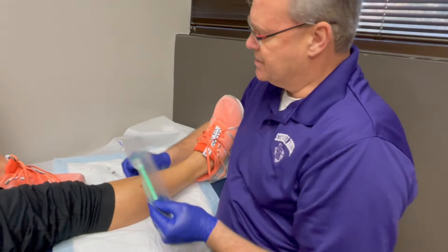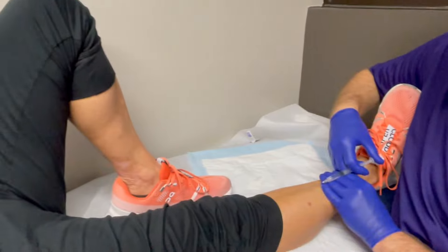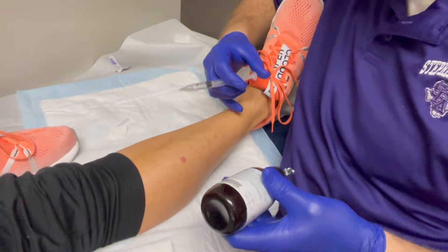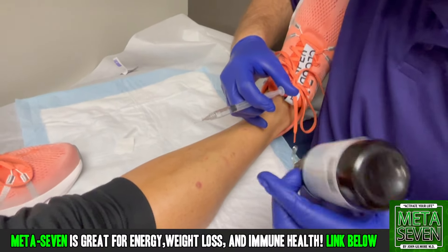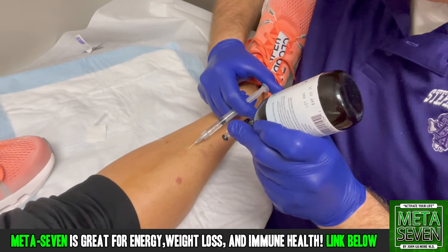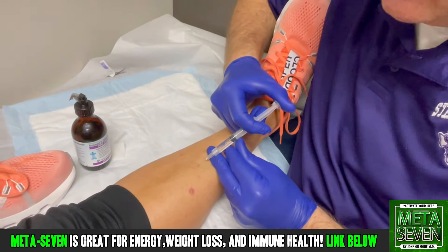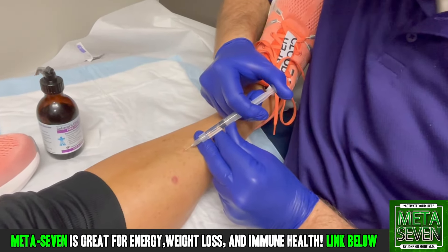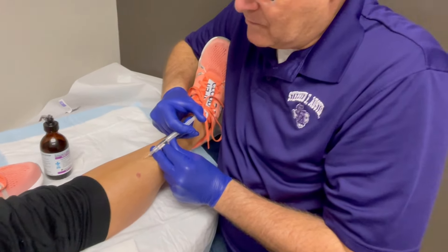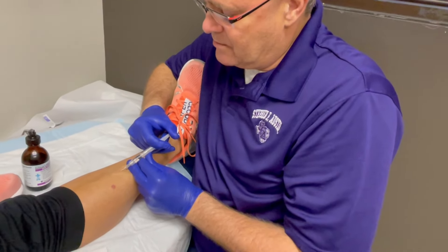We're actually going to use it as an excision tool today. Cold spray right there, right on the area. Okay — sticks and burns a little. Ready? A little stick and sting. You'll notice his gloves match his outfit today — well, clash a little bit.